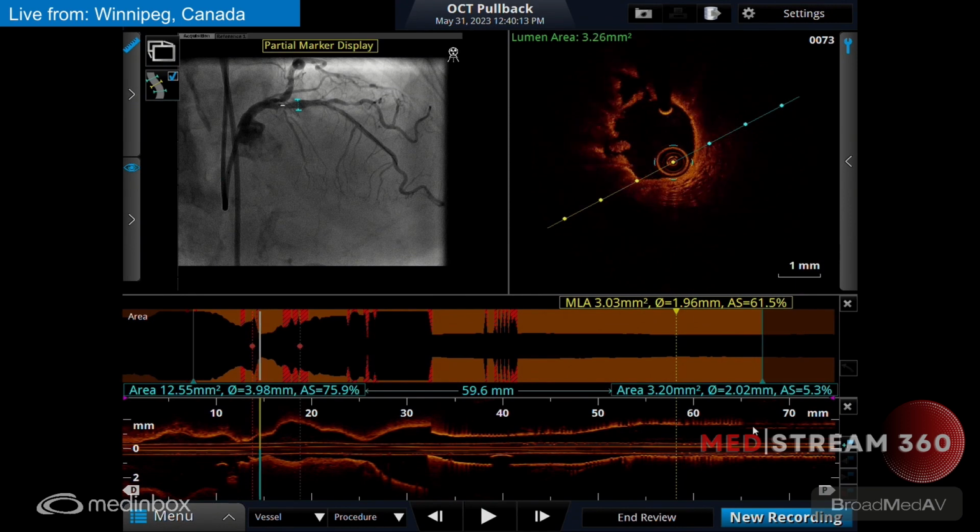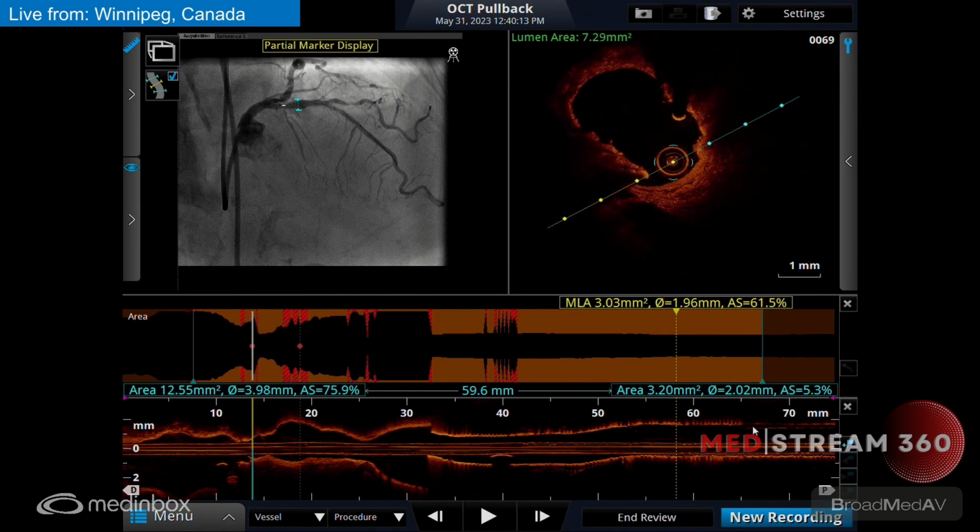I think that's a crack, maybe. It's at 9 o'clock. Yeah. Crack at 9. It's your rubber ducking. Yeah. What's your rubber duck? The rubber duck sign, yeah. Yeah, rubber duck sign. Okay, let's see if I can get the OCT in a bit more.